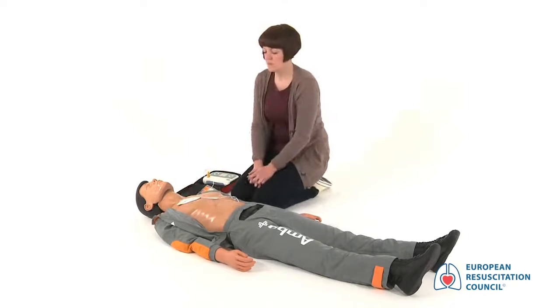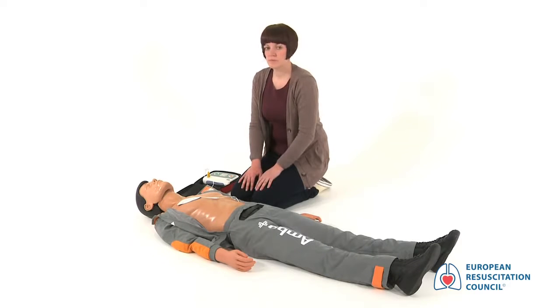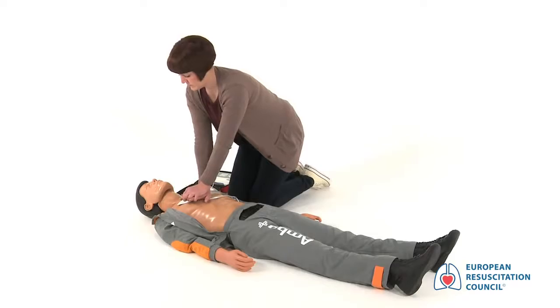Analyzing heart rhythm. Do not touch the patient. Staying clear. No shock advised. Begin CPR.